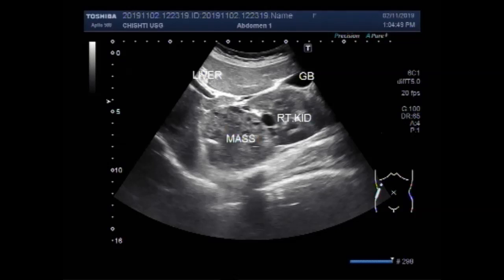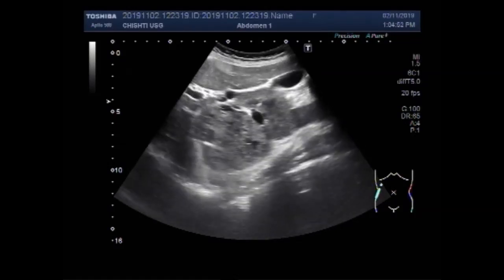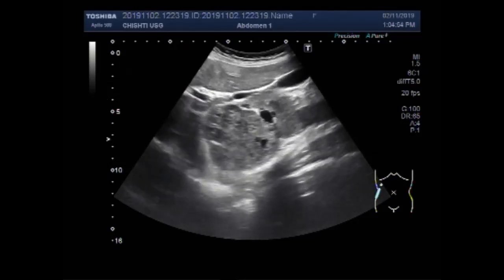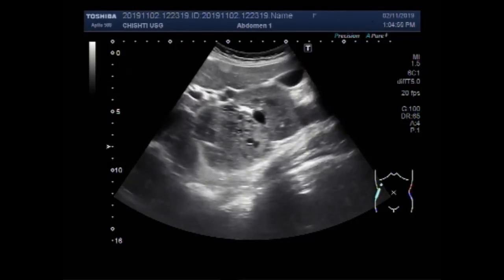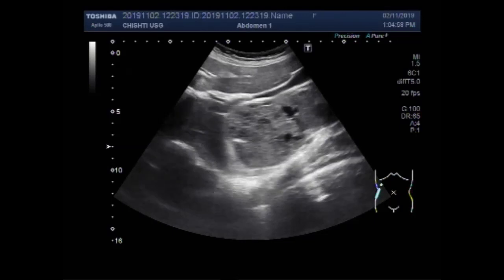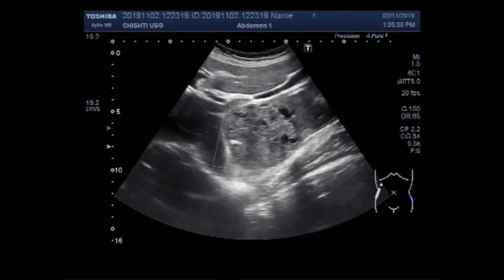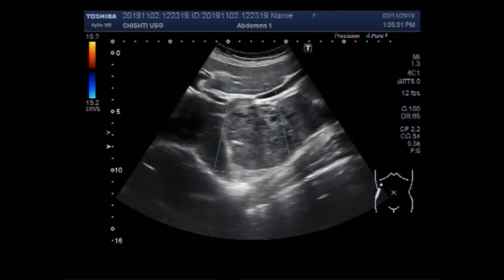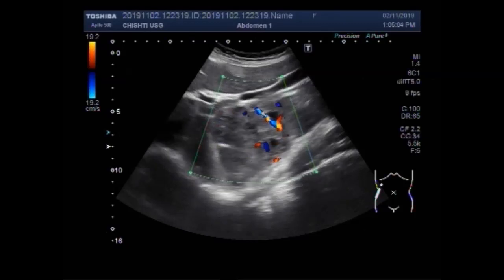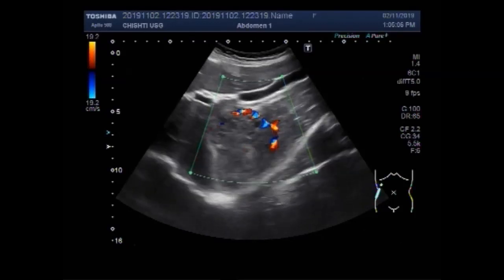You can see the mass is semi-solid to solid in consistency, round to oval in shape, and has homogeneous echogenicity. Rich blood flow is seen, especially in the rim region.